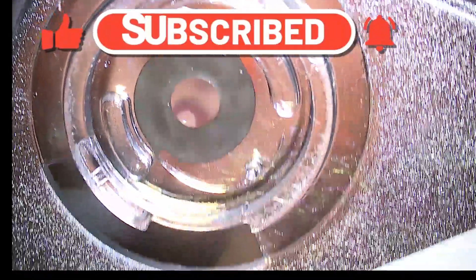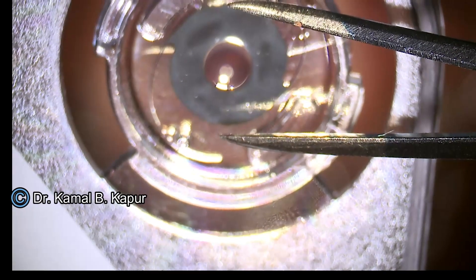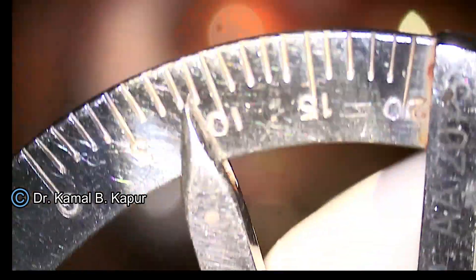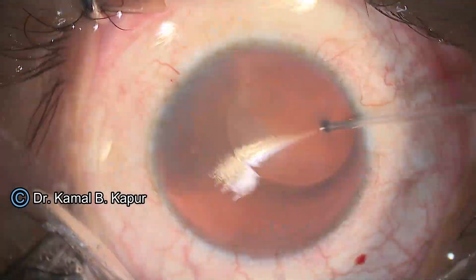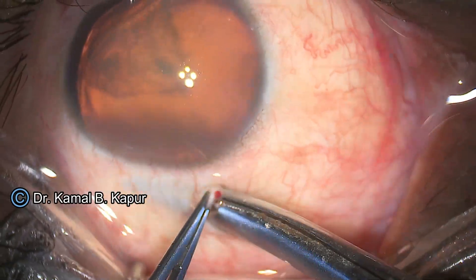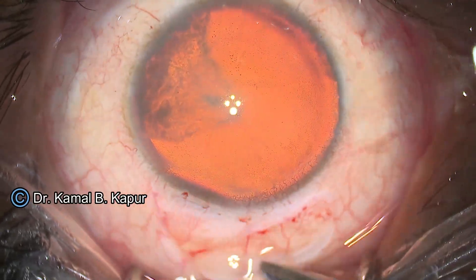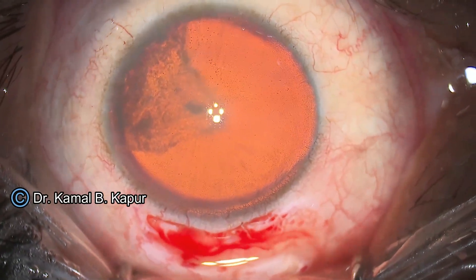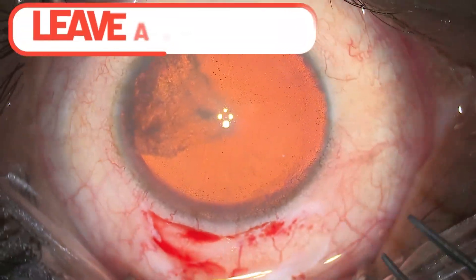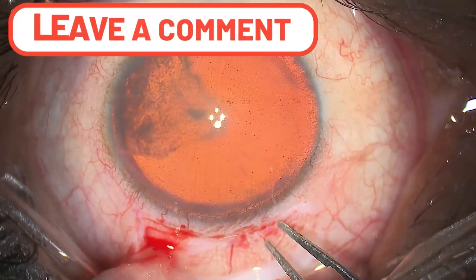The horizontal white-to-white of this patient was 12.25mm, so we got a customized aniridia lens. You can see we measured the lens at approximately 11 millimeters. This lens has a central pupillary opening of 2.75 millimeters, again customized for this patient. These patients have a lot of glare and halos and are unable to go out in bright sunlight.